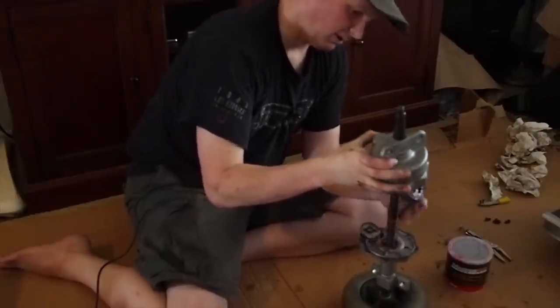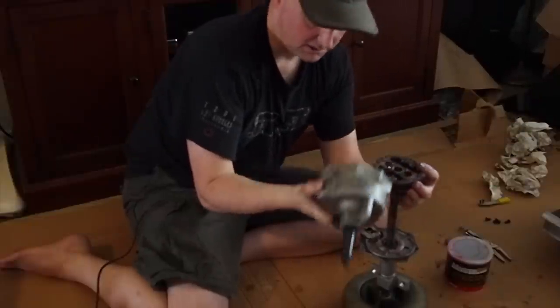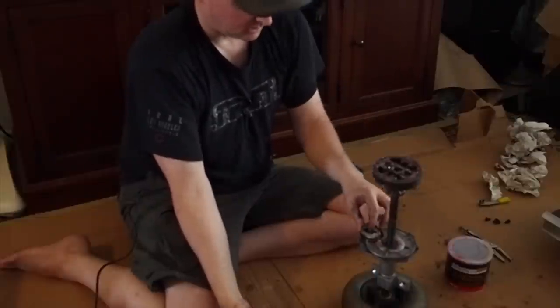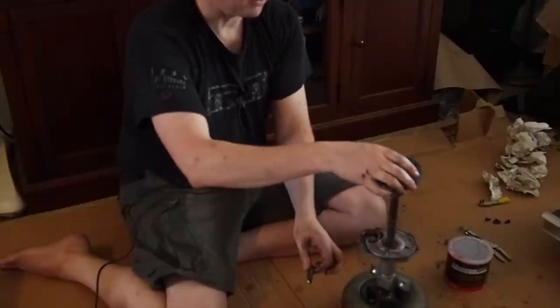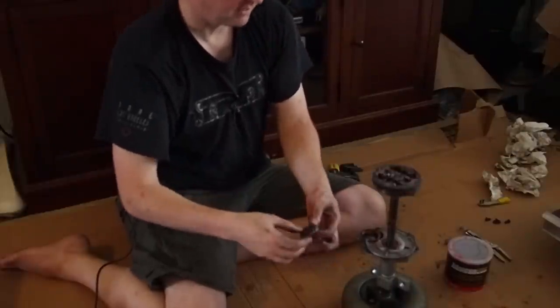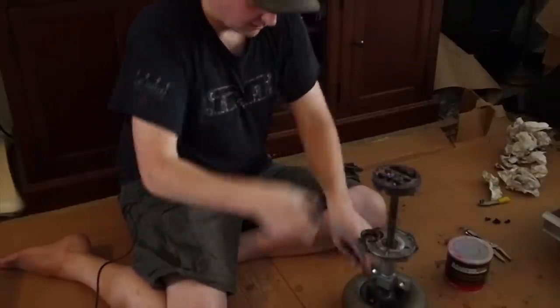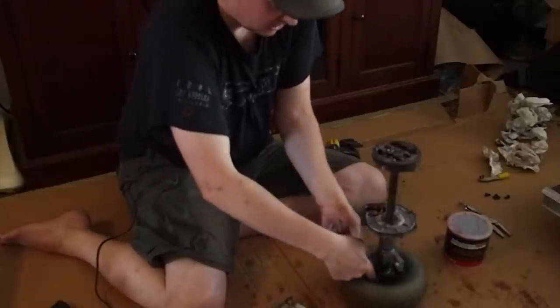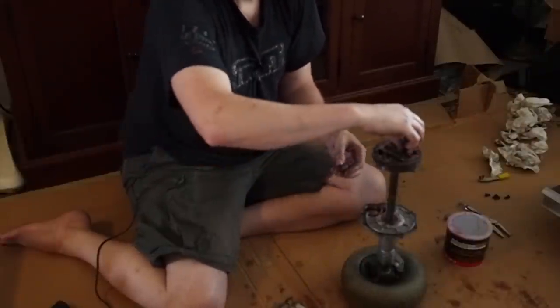We'll pull this, oh, great. That wasn't what I wanted to do. All right, but all I lost was, I didn't lose the shims, and I have this in the right order, so everything's fine there. What I lost were these gears that go inside here. That's not a big deal. Those aren't the issue. So I will just put these back in here.